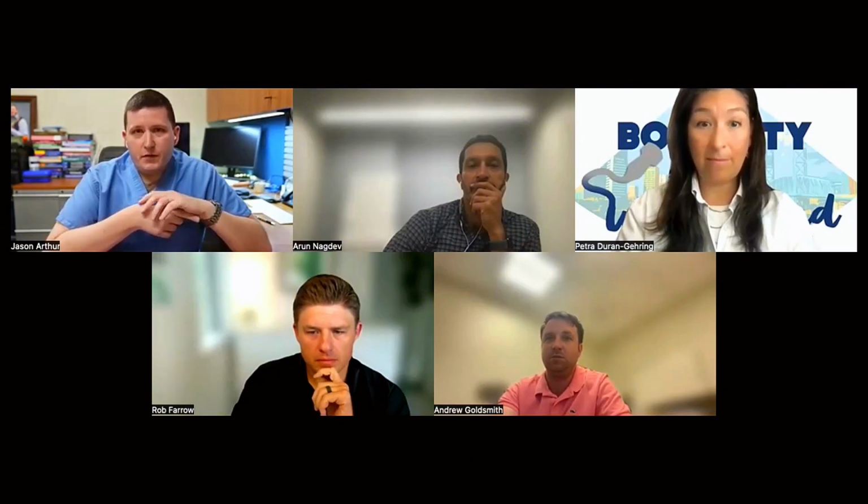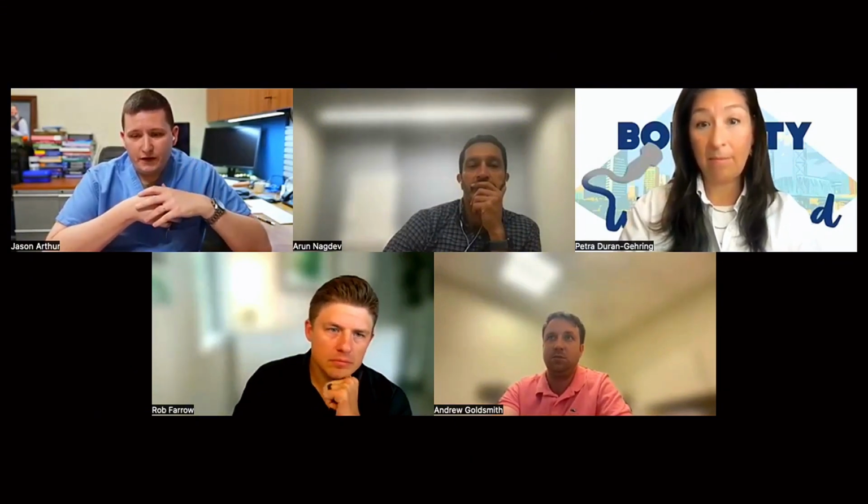So a couple of questions that came in the chat. One is, how do you navigate the natural tendency of our, for instance, orthopedic colleagues to want to get a good neurovascular exam prior to blockade, to make sure that there's not a pre-existing neurovascular injury that isn't recognized until after surgery, and that they're not inheriting that complication? And Matt mentioned, what happens if these patients go upstairs prior to being able to receive that block? I feel like in a lot of our hospitals around the country, that's becoming less of an issue with boarding, unfortunately. But I think it's a really great point, is how do you navigate that?